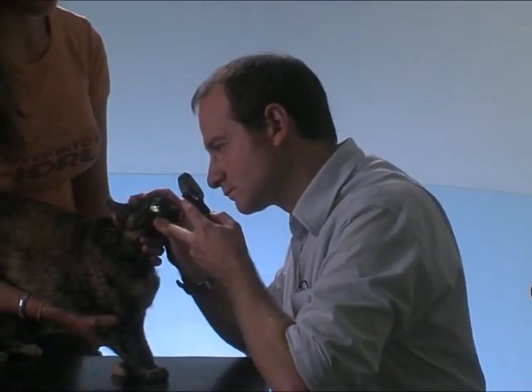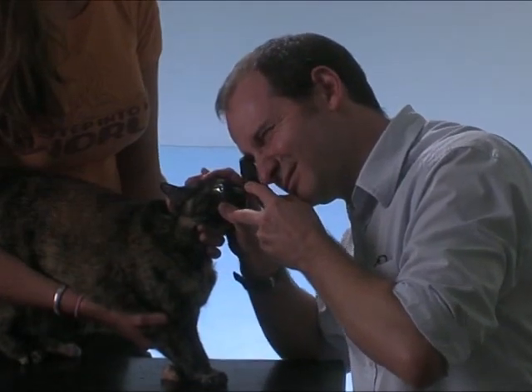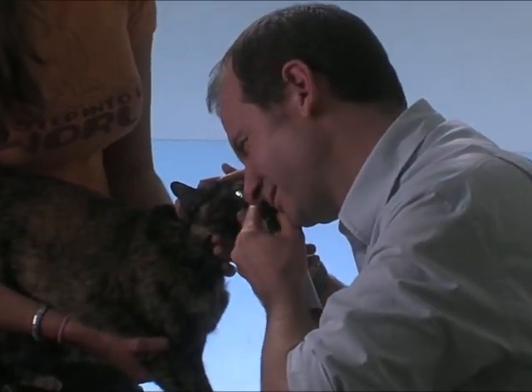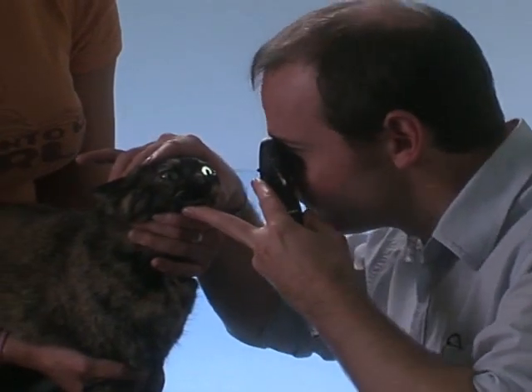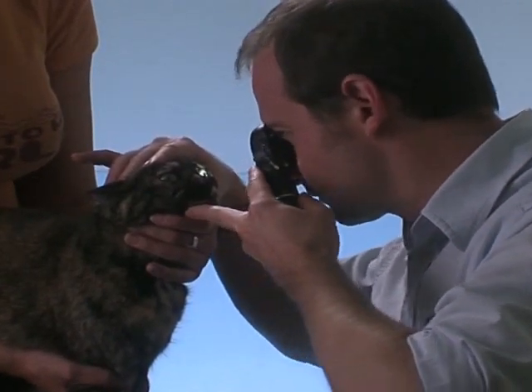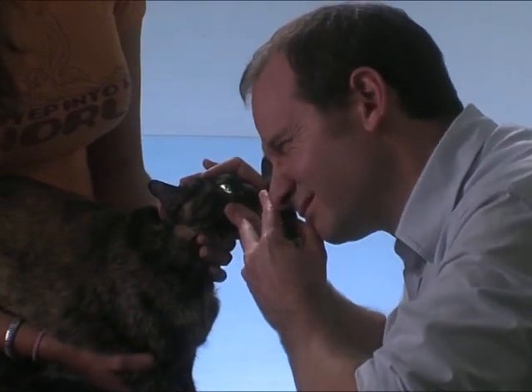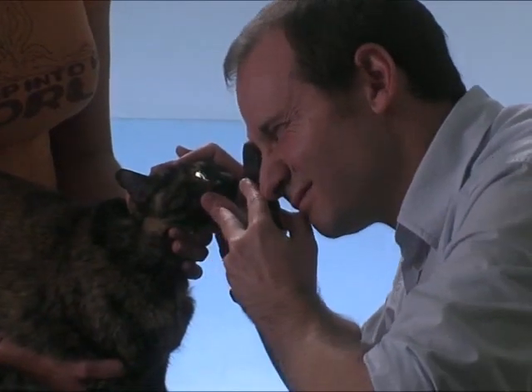It's not as important in cats purely because their nose doesn't get in the way to the same degree. However, I think it's still worth remembering that cats can bite, and so keeping your face or the ophthalmoscope between your face and the cat's teeth is an advantage as well. So again, your left eye for the cat's left eye is helpful. Examination is further aided by good restraint of the animal, including support underneath the chin.